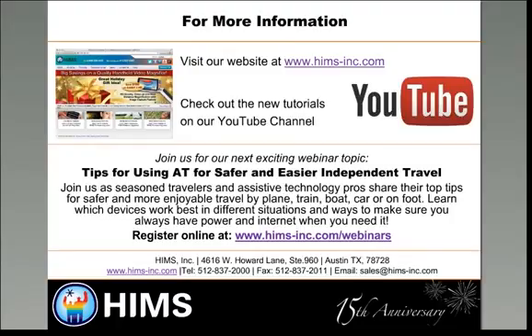So the BookSense, on the front of the BookSense, you have the number keypad and a lot of other buttons. The Blaze has similar buttons along the side for the volume and increasing the rate and the tone, but the front is simplified so that you have the three buttons to access radio, music, and books, and the button at the bottom for OCR. And then instead of the numbered keypad, you have a sort of a compass rows of buttons. You have an up, a down, a left, a right, and a select. And so that it's very, very easy to use that way.